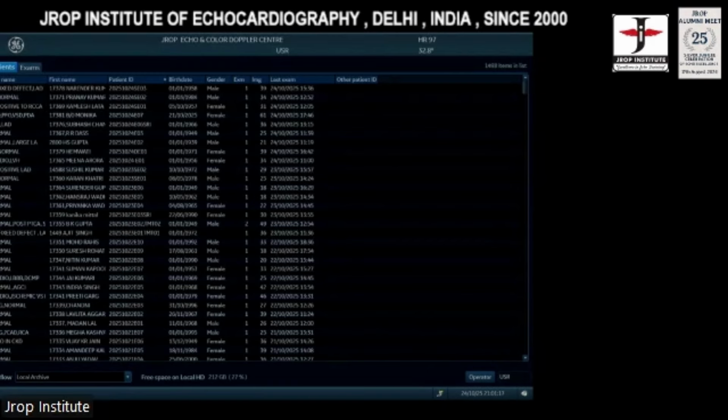Dr. Debanjana: Good evening, sir. Sir, I just wanted to know how far away from the valve we are going to place the cursor? Just distal to the valve leaflet.